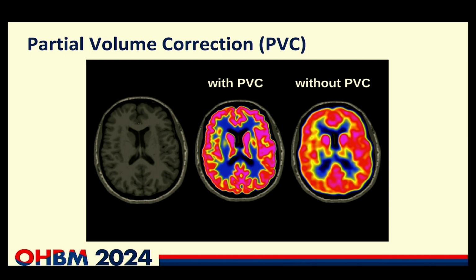So the first one, you're absolutely right, the frames are a continuum over that frame, and you could have intra-frame motion, and that gets averaged out. If you would ask some PET researchers, they would say that you cannot even do this kind of post motion correction. You have to do it while you do the scanning, and then actually put it into the reconstruction to account for it there. But yeah, it's a trade-off. So that's a very good point.